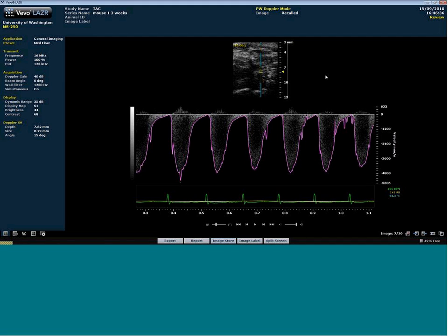That's the 30 megahertz center frequency probe. You're going to sacrifice just a little bit. I think the MS400 drops from 30 down to around 26 or 27 megahertz for Doppler, so it's fairly close to where the 710B is. If you do have models that are showing jets that are higher, then you may have to go down to the MS250 probe, the even lower frequency probe, just to get your maximum velocity. Okay.